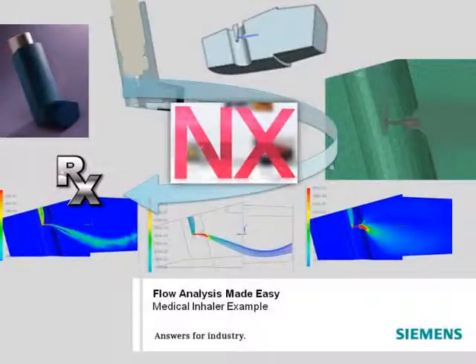NX makes it easy for you to conduct flow analysis in medical devices or many other types of products involving fluid flow. NX delivers flow results through a fully integrated environment that allows you to quickly move from design to advanced CFD faster than traditional CAE tools.